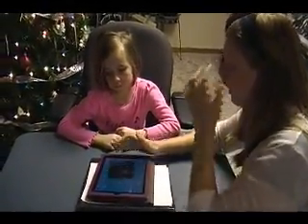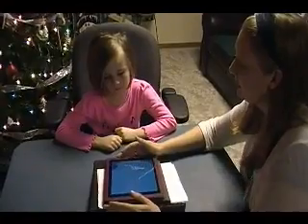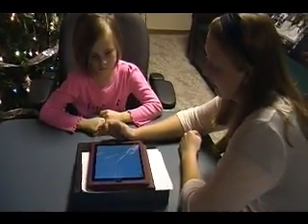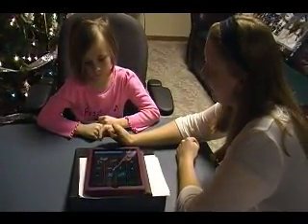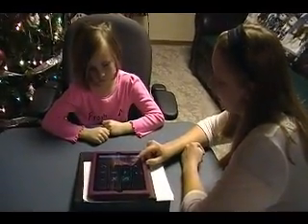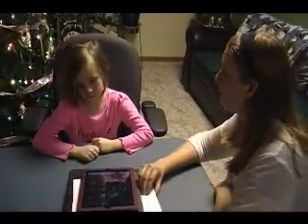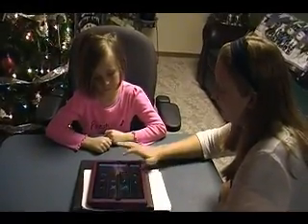So we'll go back into this one, give you another try. There's also, I'll show you this. This is for when you're a little bit older. This brings you the keyboard, and once you learn how to spell and everything, you can write things like that. You can write hi on there. If you want to tell someone something, you can turn it, or you can write it. And then there's other ones on here like toilet if you needed to use the bathroom, or lights if you want them on or off. Tissue if you need that. Your glasses, I see that you're not wearing them right now, but if you had lost them or something, someone could help you find them. And then the yes and no, which we talked about earlier, and family.